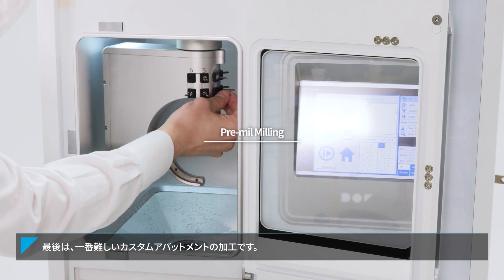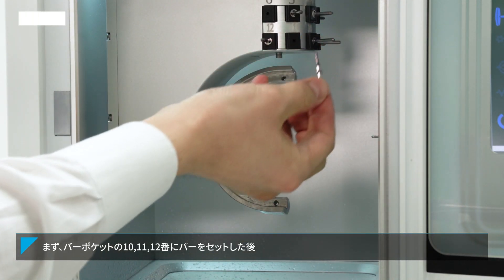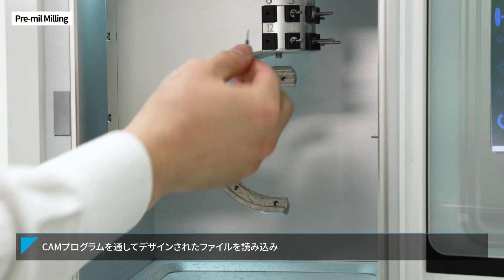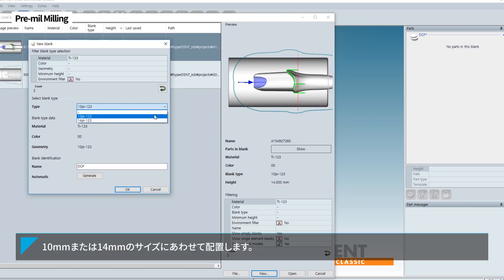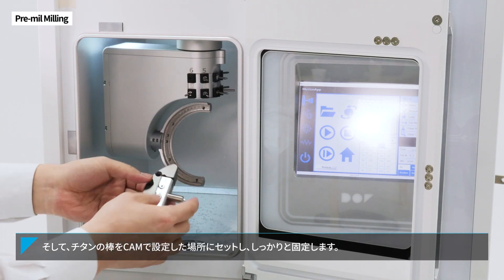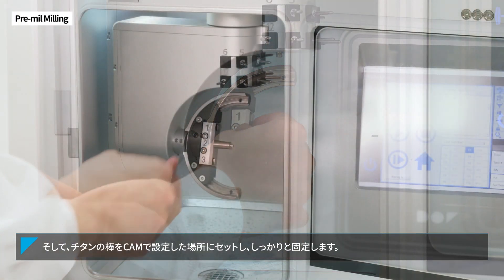And last, let's try pre-mill milling. First, insert the tools into tool ports number 10, number 11, and number 12, and then use the CAM program to place the design files in 10mm or 14mm size. After inserting the pre-mill in the same way as the slot number output from the CAM, use bolts to fix it to the fixture tightly.